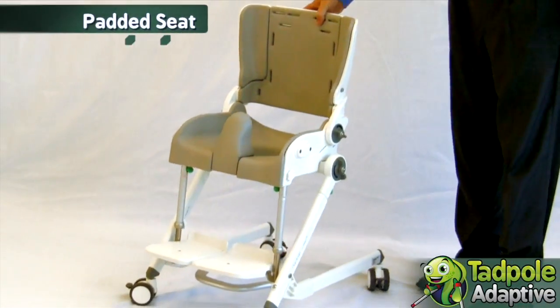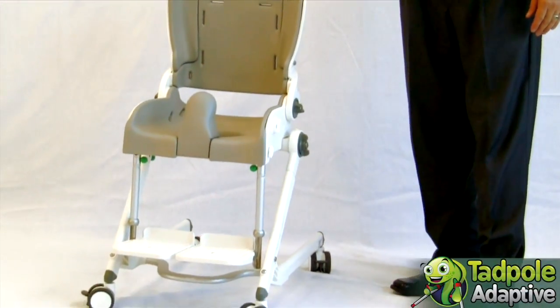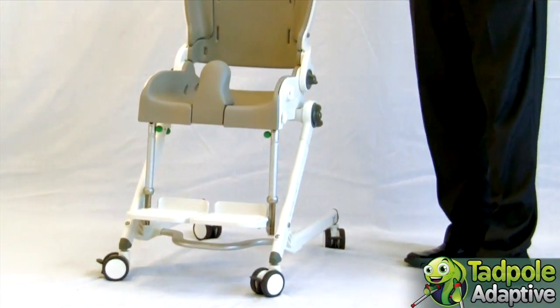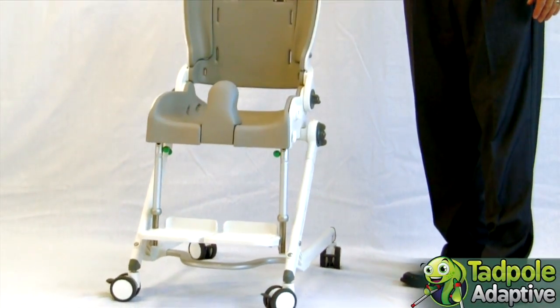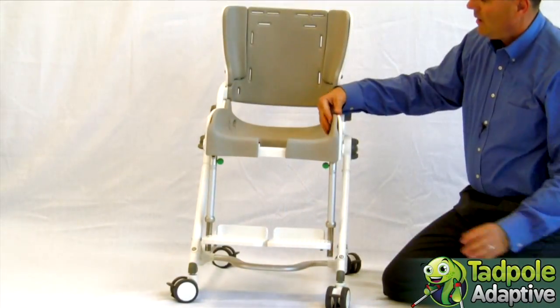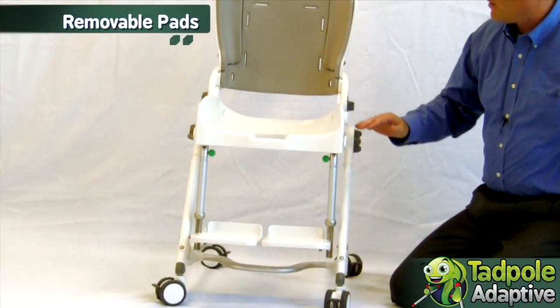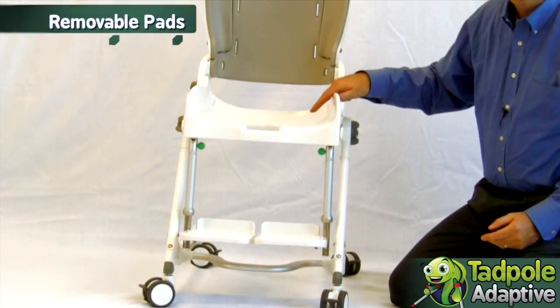The Flamingo has a padded PU seat that is impervious to water and easy to keep clean. It also makes for a more comfortable seating surface, especially against the skin. The pads are removable to clean separately, as well as to clean the base.